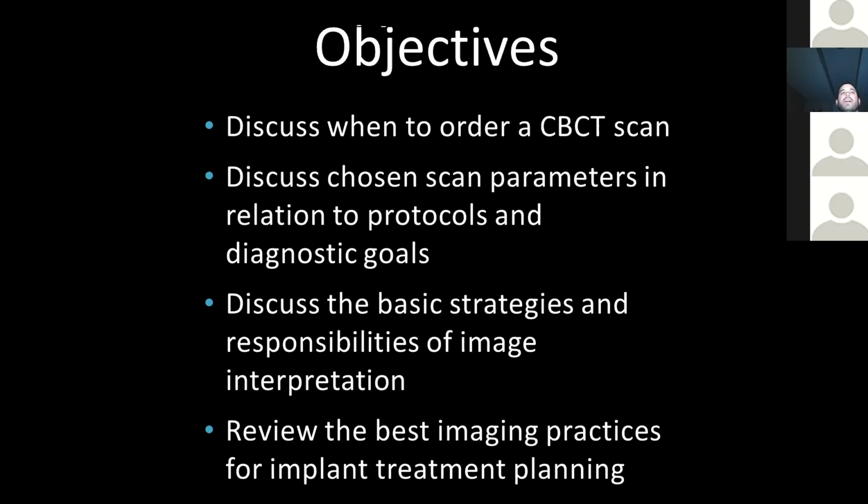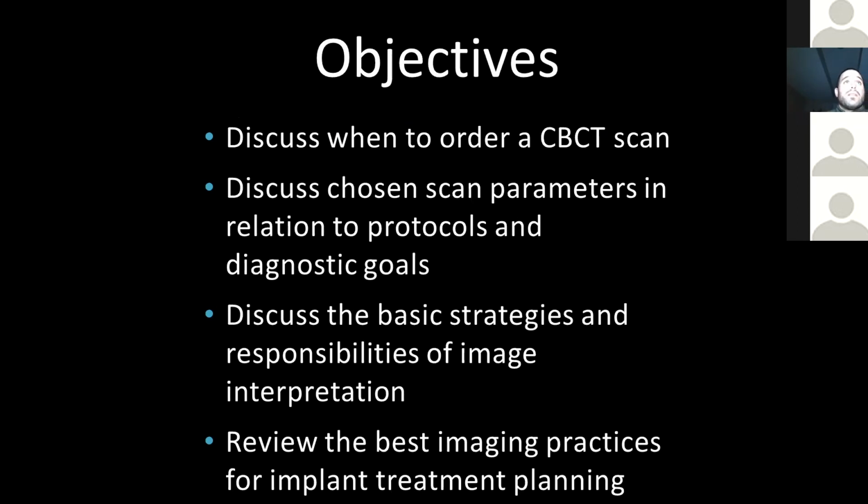Now we could dive into a couple day-long course about the timing of that, and in reality, it's a few decades. So if you have a very elderly patient in their 80s, 90s, their risk consideration for cancers later in life becomes a little different, because statistically they don't have as many years left as a young patient would. But the best assumption is that any small amount of X-ray radiation does have a risk. The smaller the radiation dose, the smaller the risk.